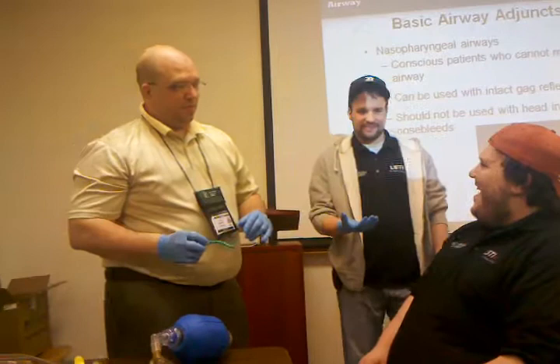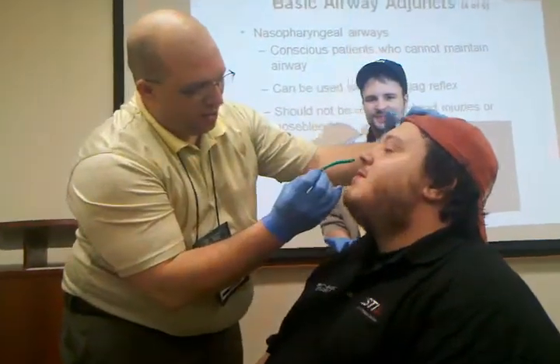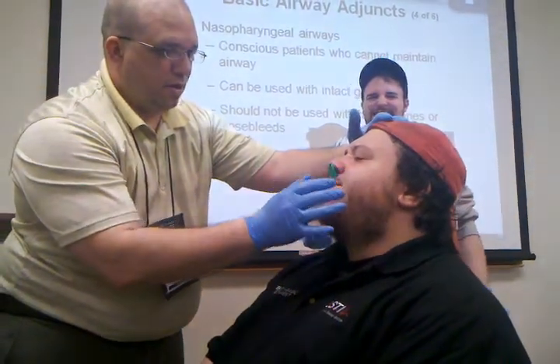Put your head back. Ready? Let's do this. We're going to take this — it's going to go quick. Ready? One, two, three. Breathe, breathe, breathe. There you go. It's in.